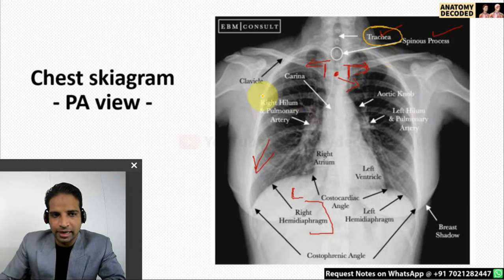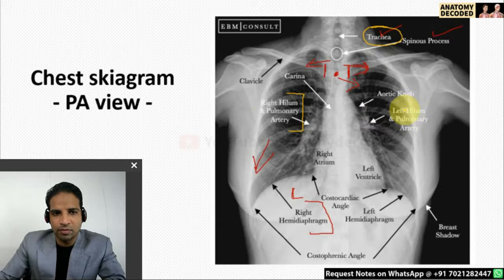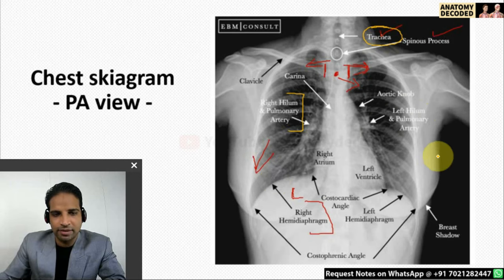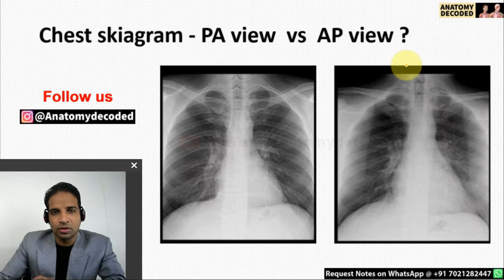The hilum is shown here — the right pulmonary hilum and the left pulmonary hilum. If it is a female chest skygram, the breast shadow will be visible, so that can also be mentioned in the soft tissue shadows. This was about describing the plain skygram postero-anterior view.